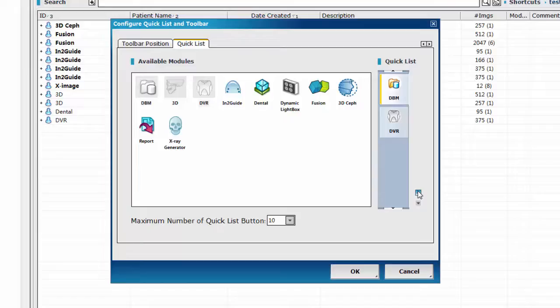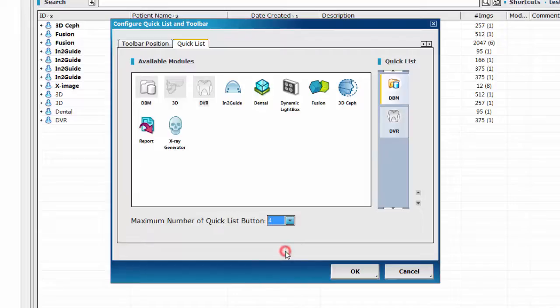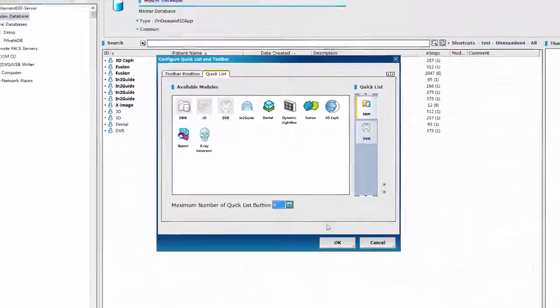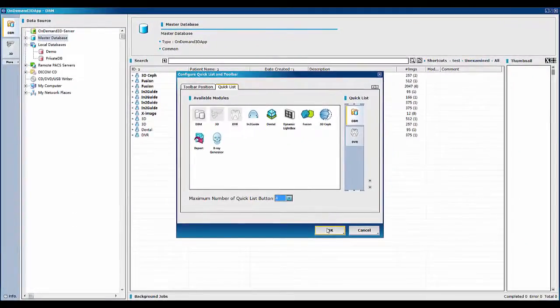Besides, you can also select the maximum number of quicklist buttons to be shown. Press OK and you will see the changes.